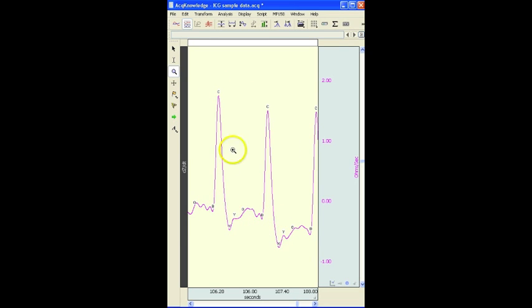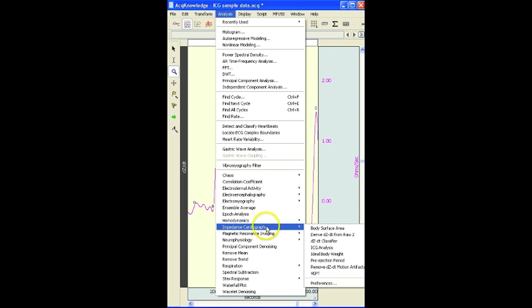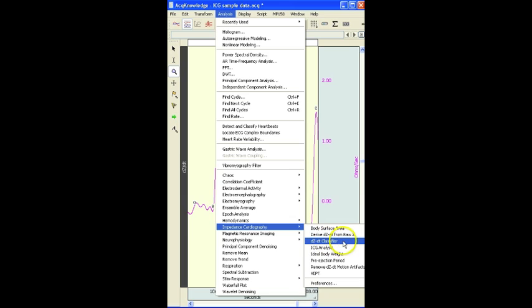Anyway, that concludes this demonstration of the ACKNOWLEDGE impedance cardiography DZDT classifier.